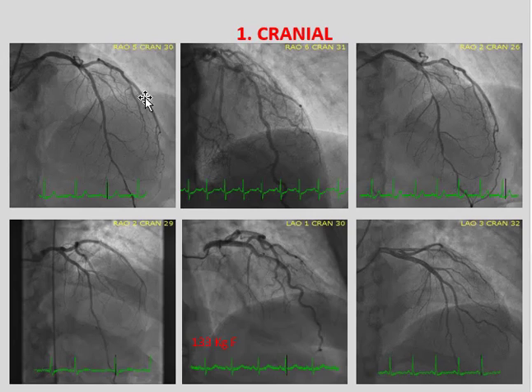Now this is a cranial view with a very slight RAO angulation. All of them do that. You're not likely to have too many that are perfectly zero. So these are representative of what you're going to see with a cranial angulation. Cranial, that pencil going diagonally across from top to bottom, left to right. I'm talking about the screen's left to right, not the patient's left to right. It's your view. You're looking at your own chest now.